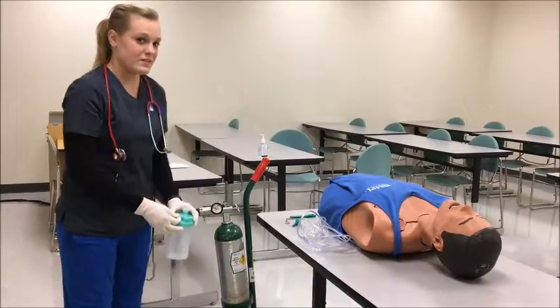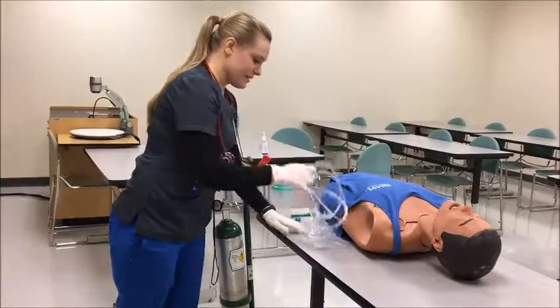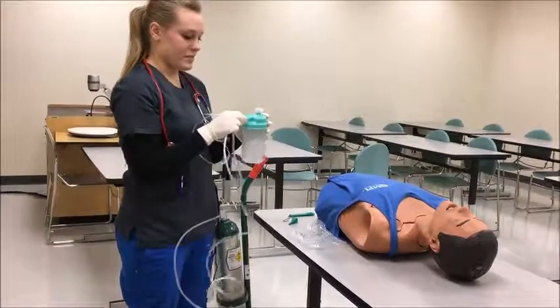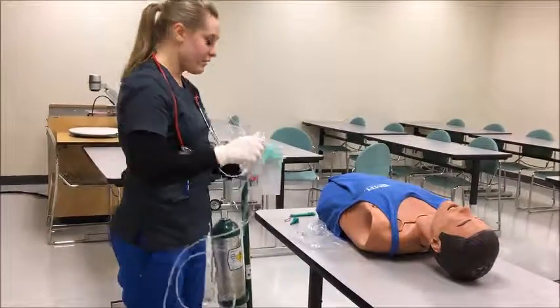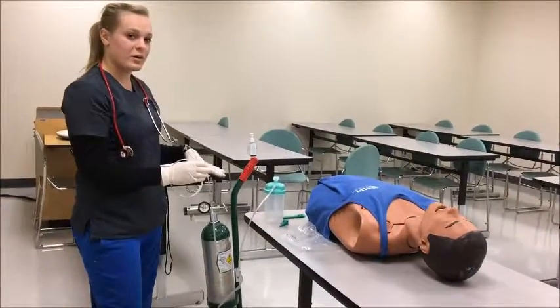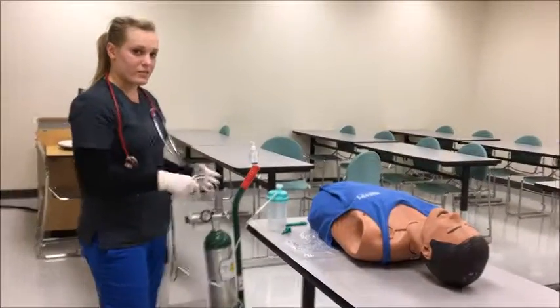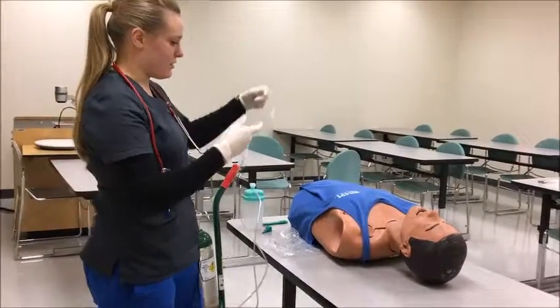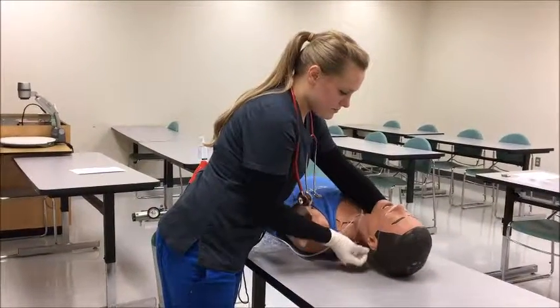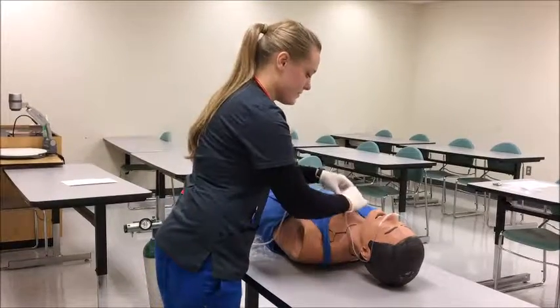For the purposes of this video, I'm going to pretend it's attached. So this nasal cannula port would go in the humidifier. I'm going to make sure that everything is working properly. The pop-off valves are not open. Oxygen is flowing. Everything's working correctly. And I'm going to put the nasal cannula on the patient, making sure he's comfortable and everything's fitting correctly.